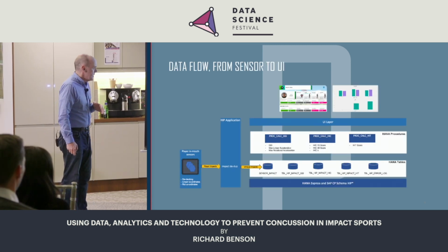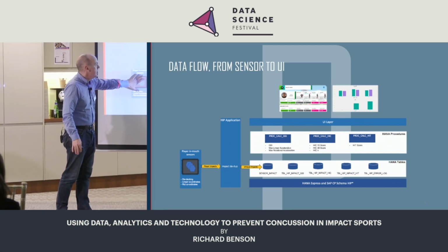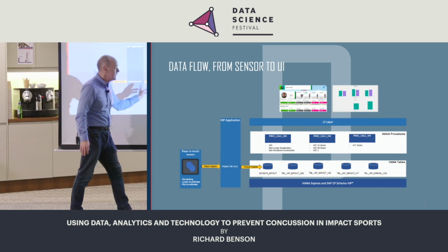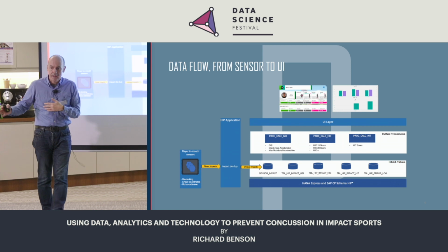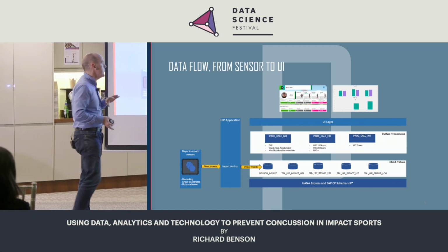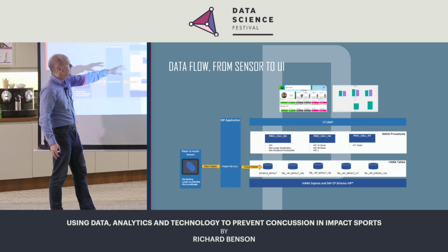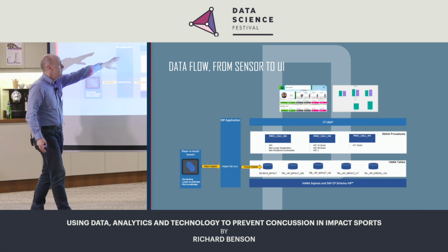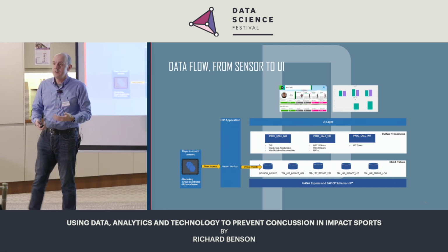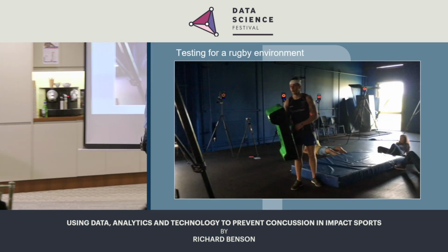In terms of architecture, you don't stand a chance of reading this, but anyway, in-mouth sensors going into the head impact application, which is basically a ton of tables storing X, Y, Z accelerations, rotational accelerations, a bunch of calculations which I will go into in a follow-on slide, so don't worry if you can't see it. And then that gets up-leveled into something that the medics can actually see and intuitively use fairly easily on the side of the pitch. So another video moment.